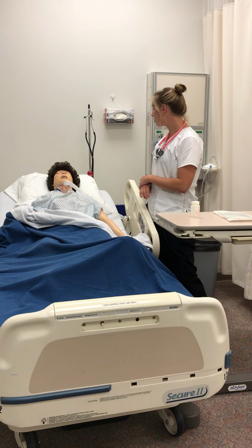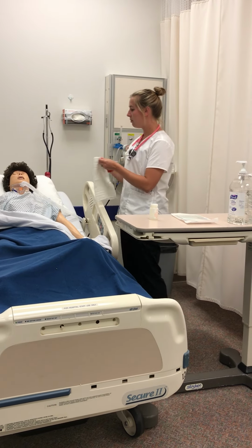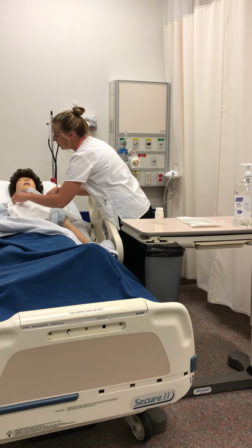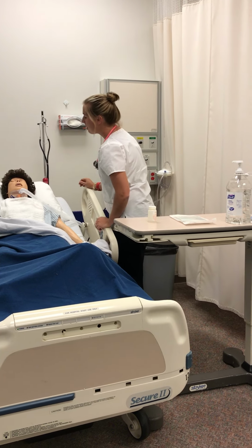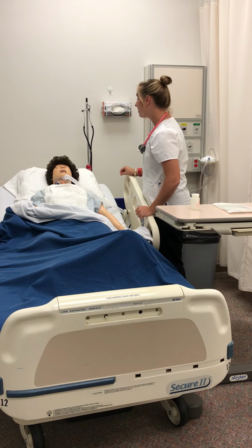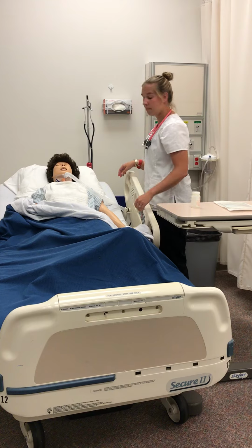Gretchen, we're going to do some trach suctioning today, okay? So I'm going to place this little cloth underneath to catch any secretions that may come out during this procedure, okay? So this whole time I'm going to have you breathe deeply and cough, okay? Anytime you feel like you need to cough, go ahead and do it. That's going to help release that mucus and let us suction it up.